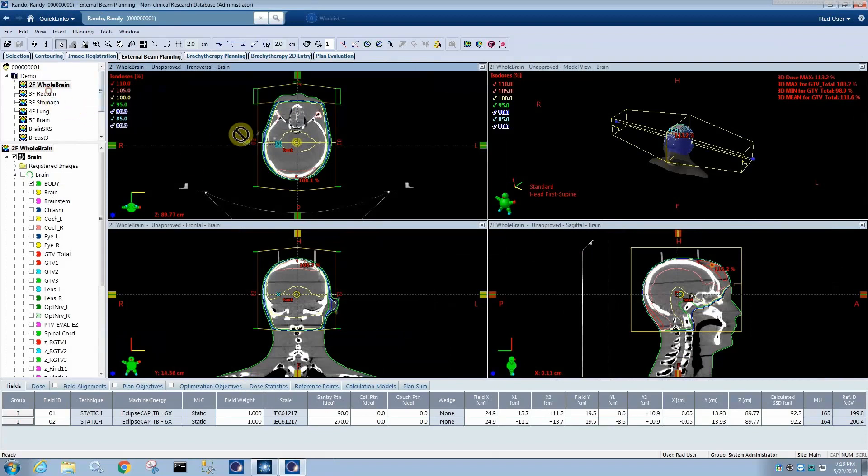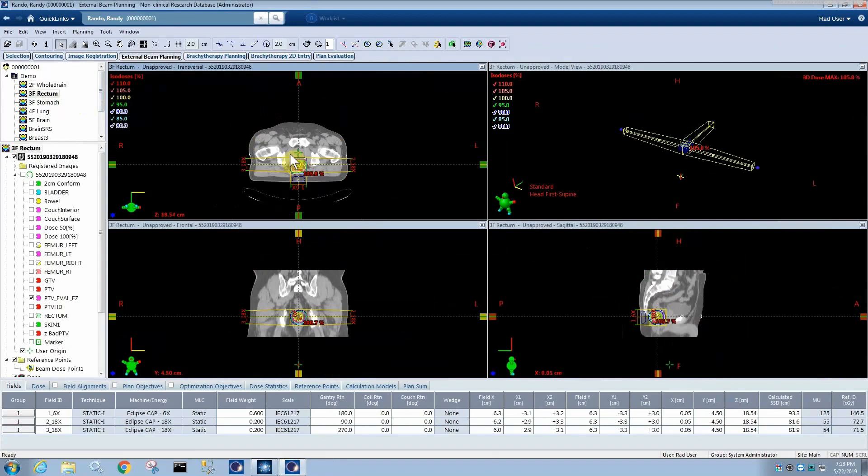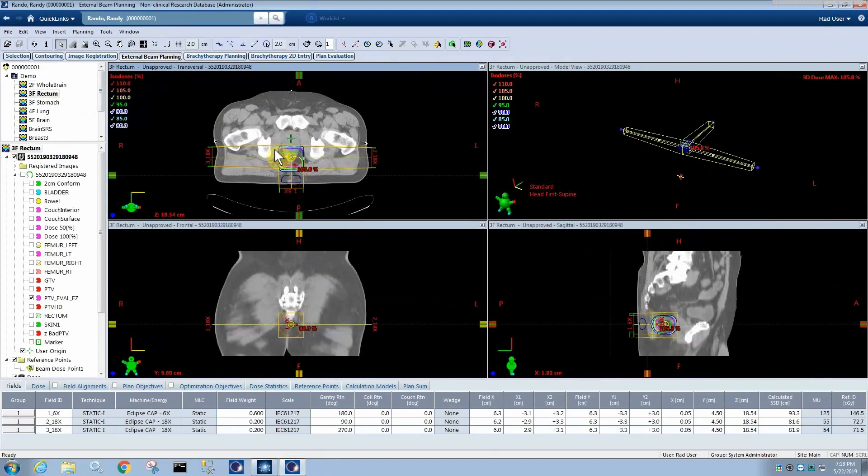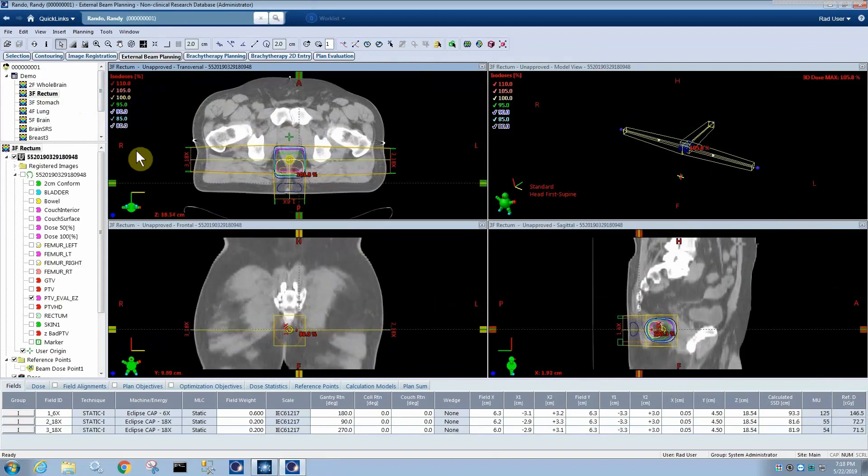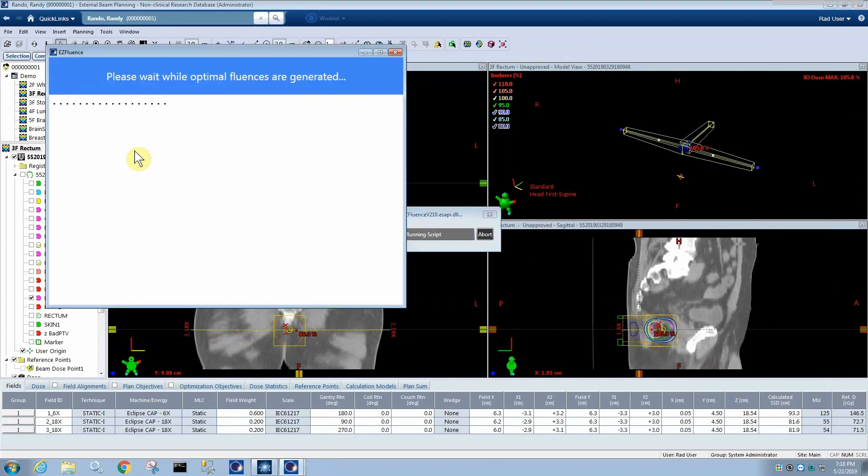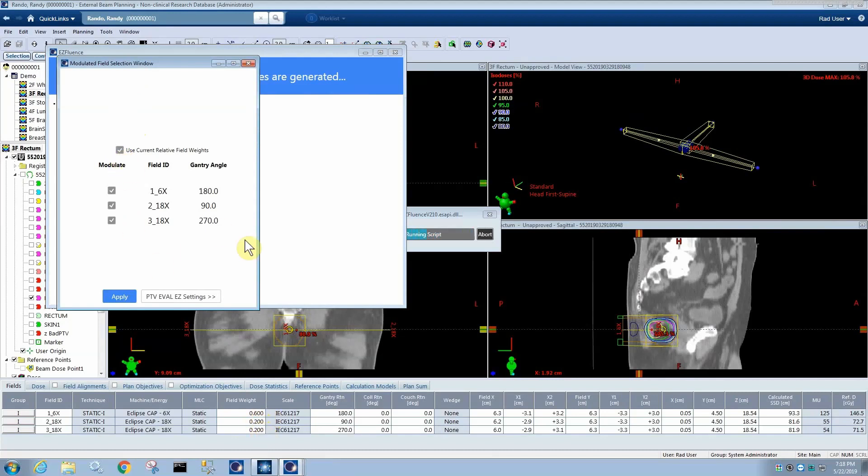So now the new version of EasyFluence version two supports multiple different sites and, as I said, arbitrary beam arrangements. So you'll see that the user interface is a little bit different when this happens. So you'll see initially when you run it on a plan that has an arbitrary beam arrangement, which means it's not nearly parallel posed, you're going to have this field appear where you can decide to use the current relative field weights, in this case 0.6, 0.2, 0.2.